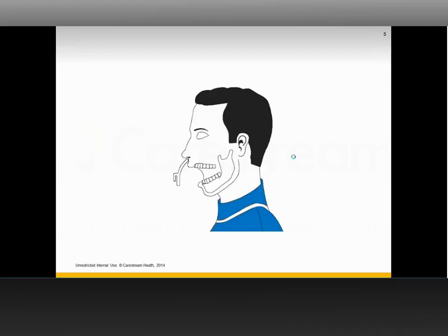Once you stabilize the head, you have to stabilize the jaw in an open view. How do you do that? Even though it's a short duration of time, you can use an intraoral bite block to keep the patient's mouth open so that the patient can bite on it and avoid any kind of muscular spasms that could create motion artifacts. Motion artifacts are one of the major reasons why scans don't look good. Again, let me emphasize, the fast scan mode is the best way to go. When you keep the mouth open for as short a duration as you can and use the fast scan mode, you avoid most of the possibilities for capturing motion artifacts.